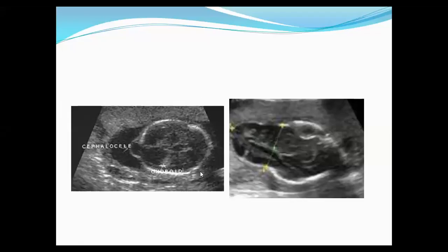This is the ultrasonographic picture of a defect in the skull in the occipital region, diagnosed as encephalocele. This is an image of the more obvious lesion of a large defect in the skull bone, also representing encephalocele.